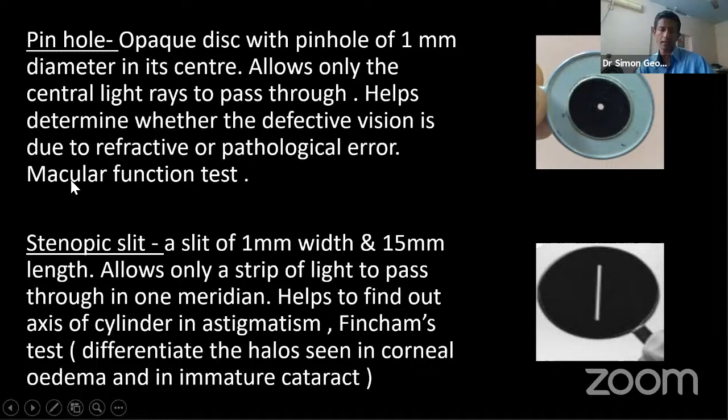And this is also said to be used as a macular function test because the central lateral rays are falling on the macula. As Dr. Sunil mentioned, macula is the most sensitive part of your retina.